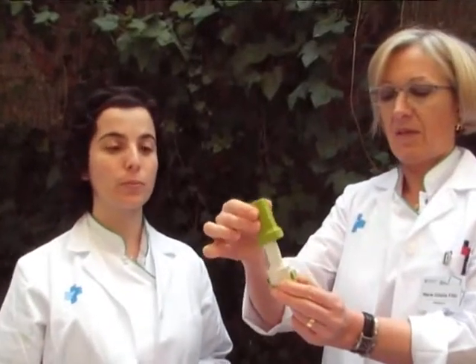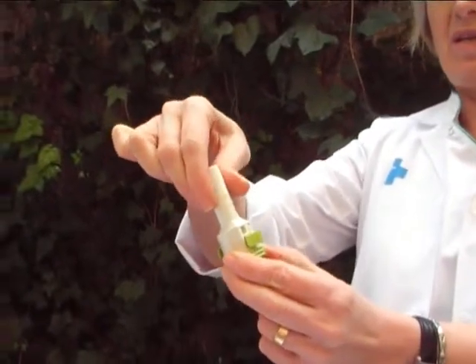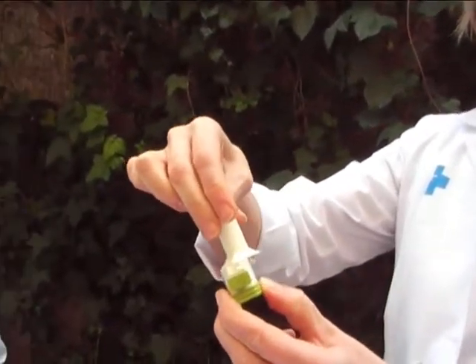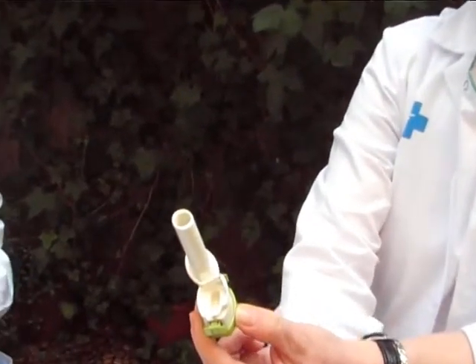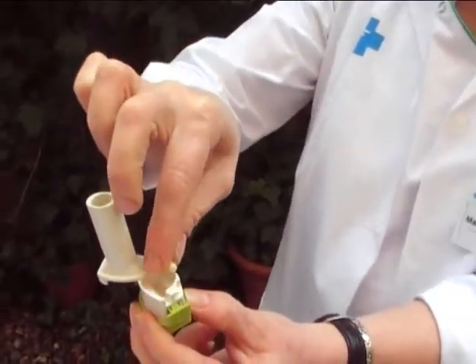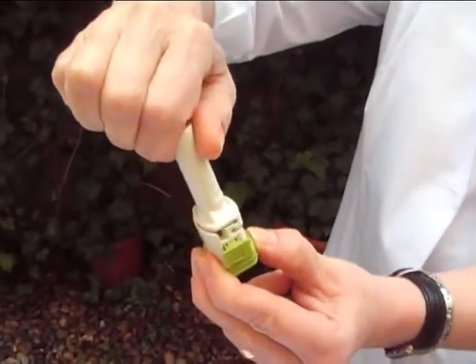Firstly, pull off the cover. Open the mouthpiece by twisting it to the left. You will clearly see the chamber where the capsule should be placed. Put a capsule in the chamber. Close the mouthpiece by twisting it back to its initial position.